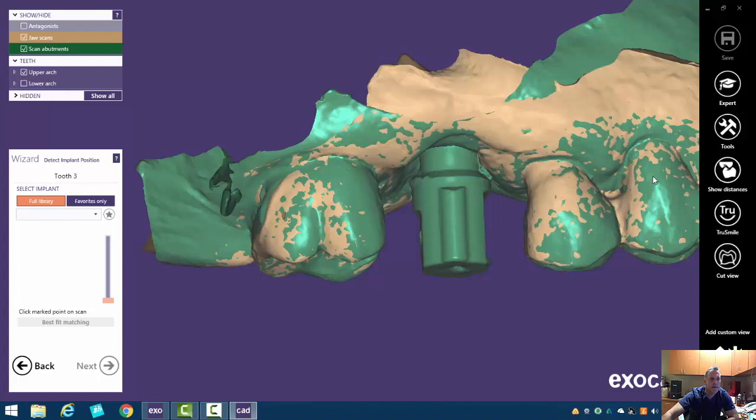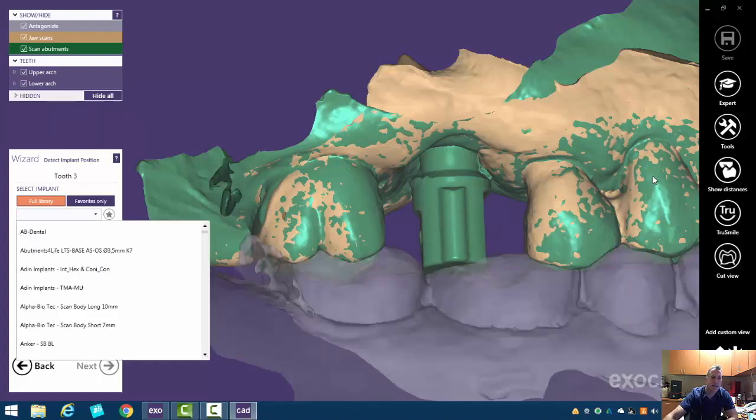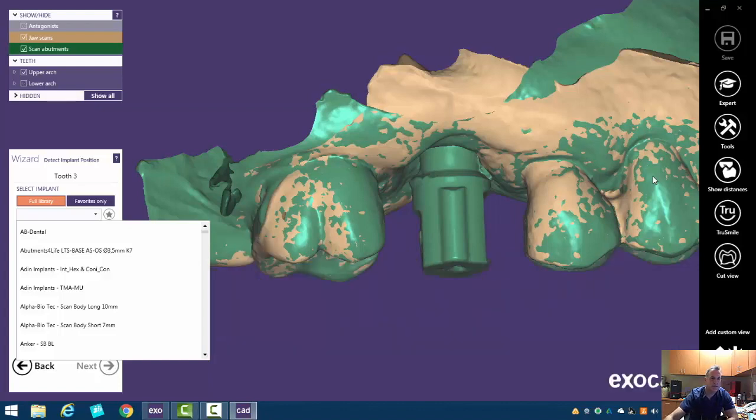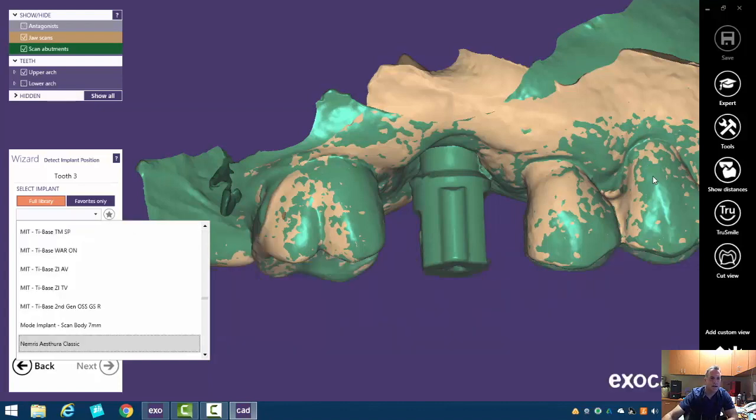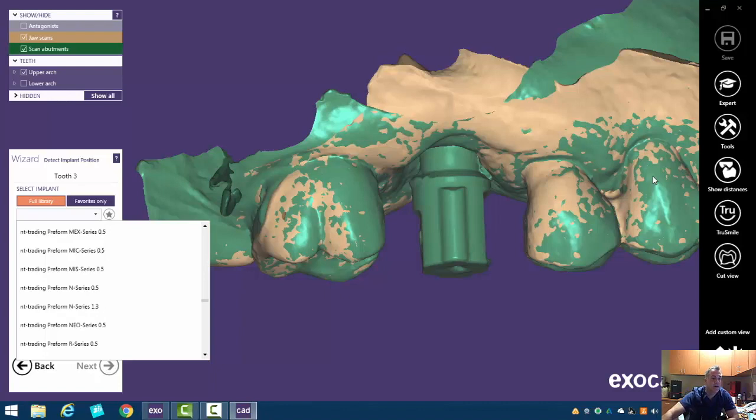So when we click on this, it takes a little while to load up. I'm going to hit N to put us towards NT Trading. This is a Zimmer compatible one. Don't ask me why, but it's called the R series.